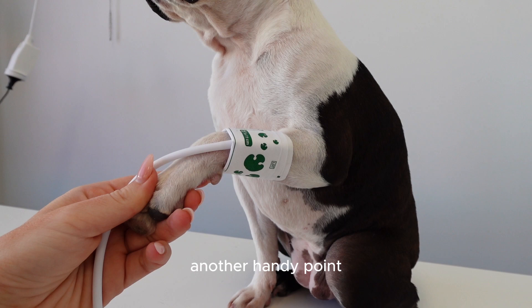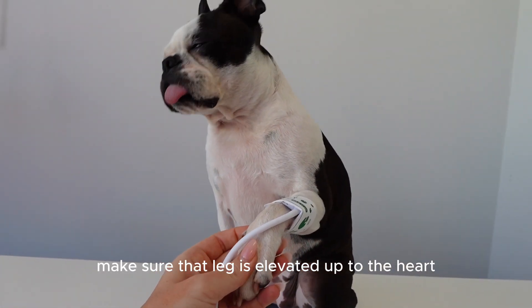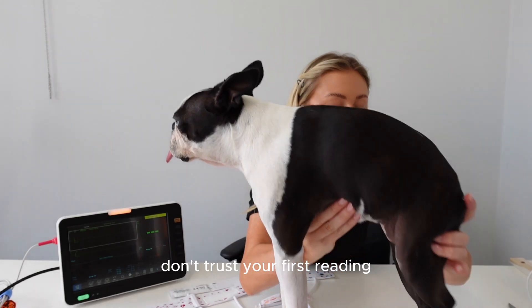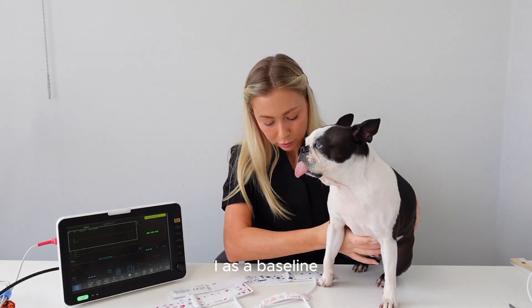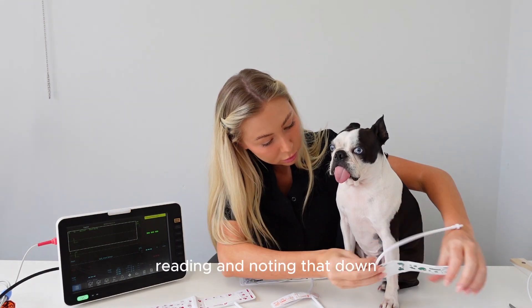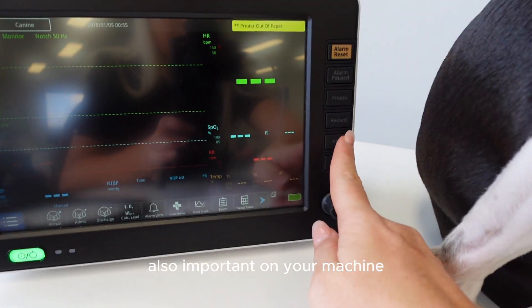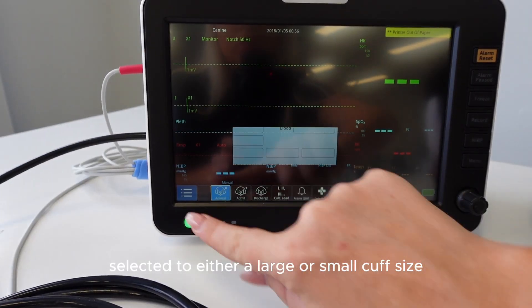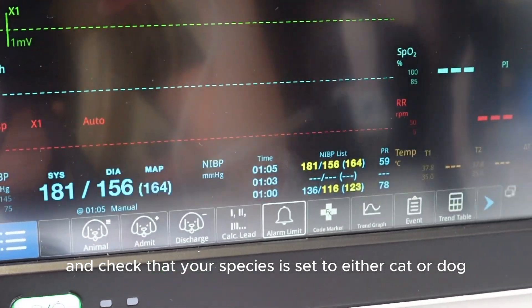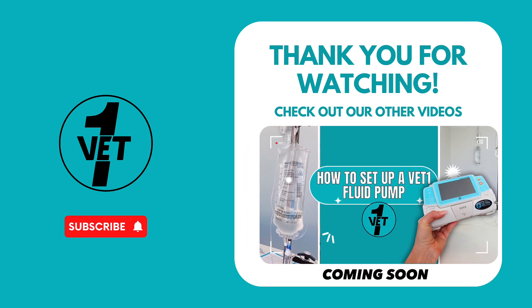When taking blood pressure in an awake dog, make sure the leg is elevated up to the level of the heart. Also, don't trust your first reading — as a baseline I run through three readings and then start noting those down and plotting them on my anaesthetic chart. Finally, on your machine make sure it is set to either large or small cuff size, and check that the species is set to cat or dog, because that makes a huge difference. And that's just the basics for choosing the correct blood pressure cuff.